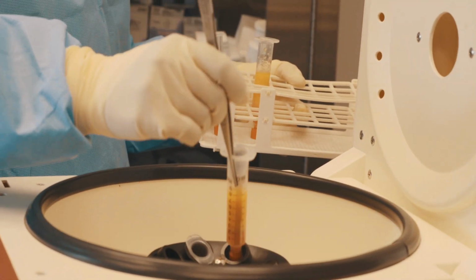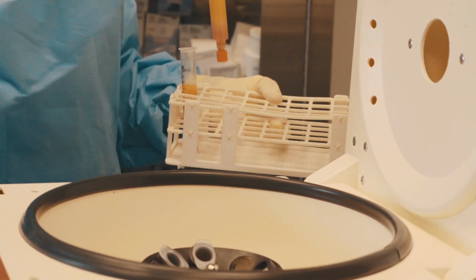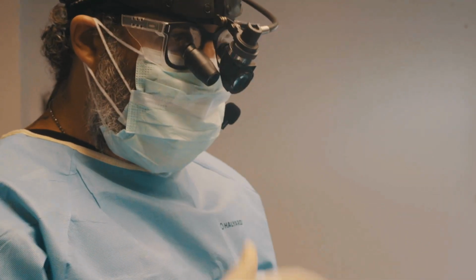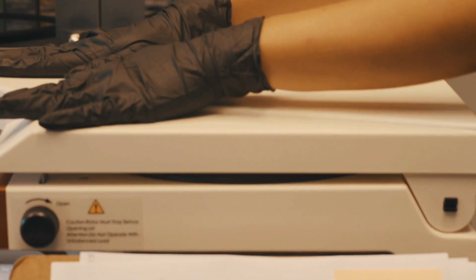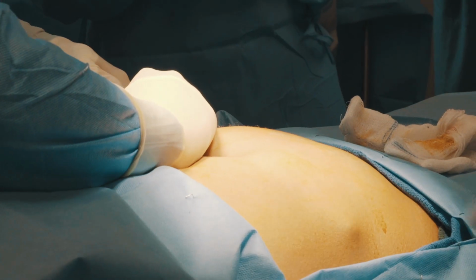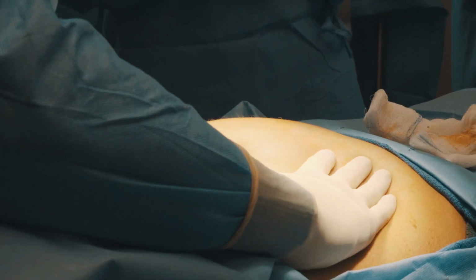That is a centrifuge, and that's going to help us get more of a pure cleansed fat. So you'll see a separation of the oils, the local anesthetic that was injected, and the fat. The fat will be nice and creamy and yellow. And then we'll transfer that into another syringe. 3 mLs back. Good. Now you should go back and forth, spokes in the wheel.